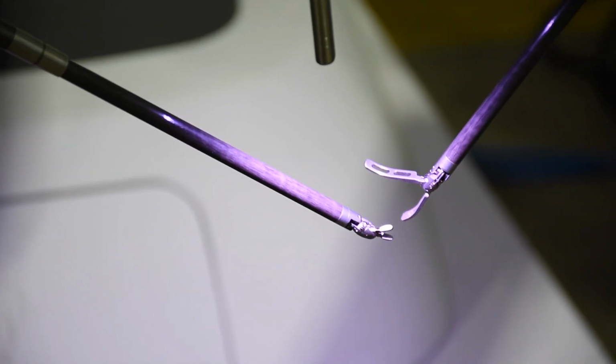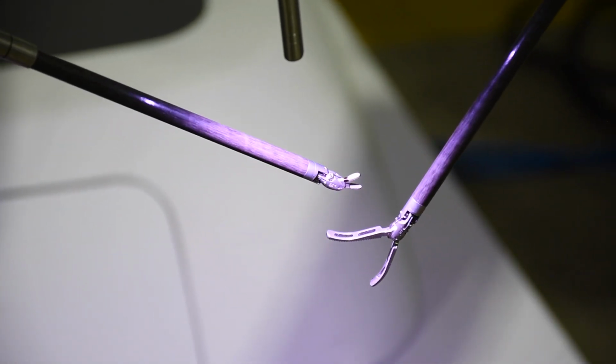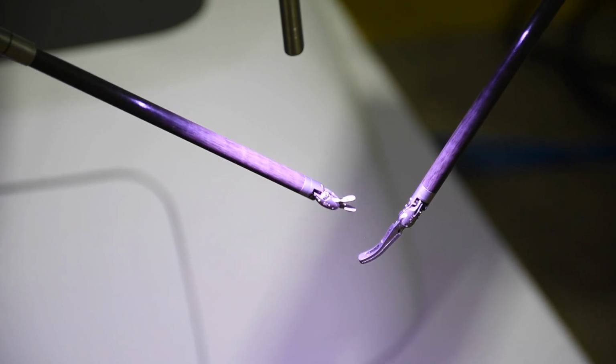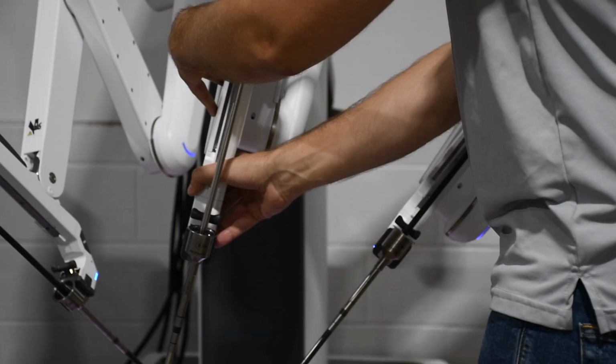And exactly what type of surgeries do the robots assist with? The Da Vinci robots, they perform soft tissue procedures, urology, gynecology, and then other types of robots such as Stryker Mako does orthopedics type procedures, hips, knees, joints. There's more than just those, but Johnson & Johnson has something called the Auris Monarch, and that can do different types of bronchoscopy procedures as well.